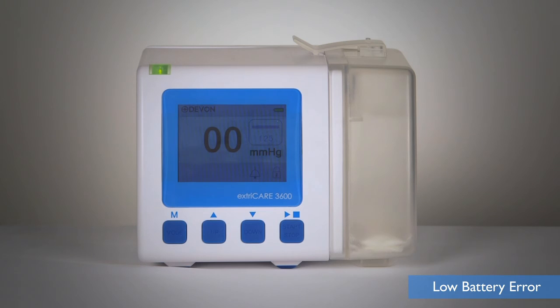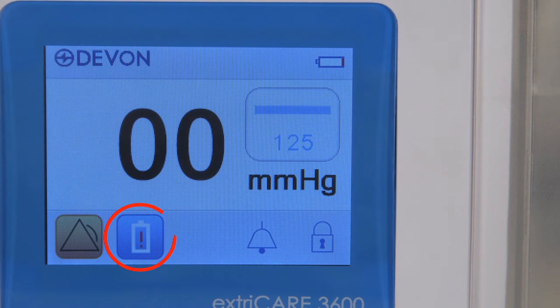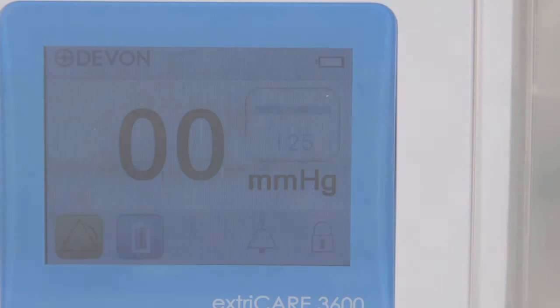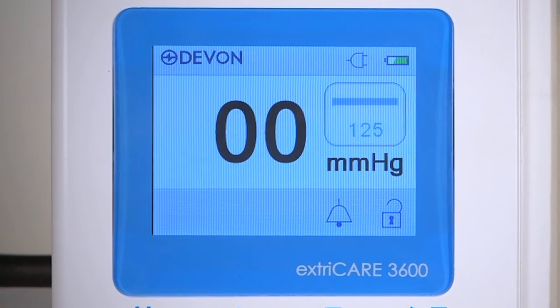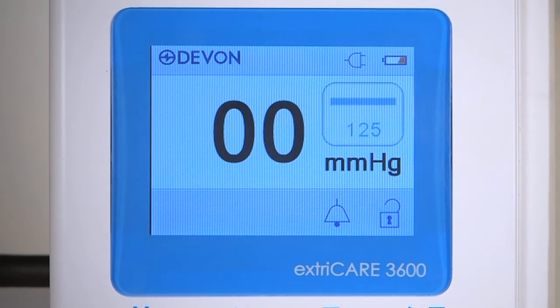Once there is less than 10% battery power remaining, an alarm will sound. The LED light will flash yellow and the low battery symbol will appear on screen. The pump will continue pumping until the battery is completely depleted. Plug in the ExtraCare 3600 into a wall outlet to allow it to charge and function at the same time. The ExtraCare 3600 will be fully charged after 5 hours.